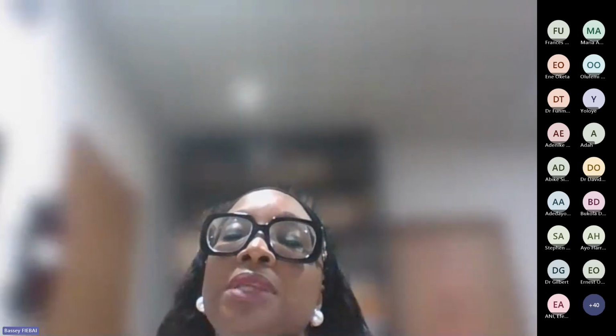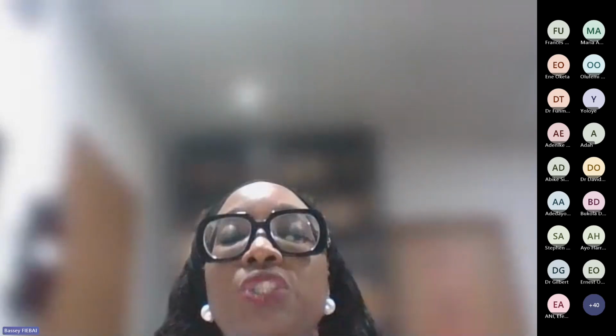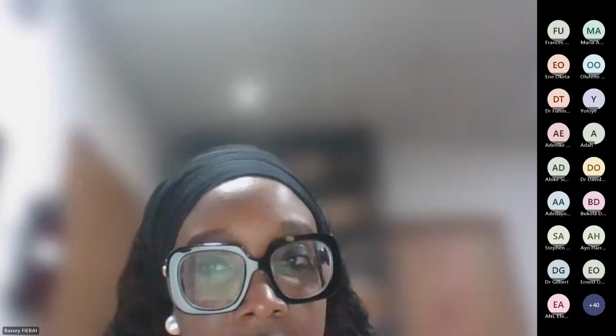Okay, yes, you can have it, and you will see. That's why you have to scan in different orientations. So you will definitely see your dome-shaped mass, and you will definitely see another membranous opacity. So you have two types of membranous opacities that you're seeing, because you can have 2 or 3 or even 4 pathologies in one scan.